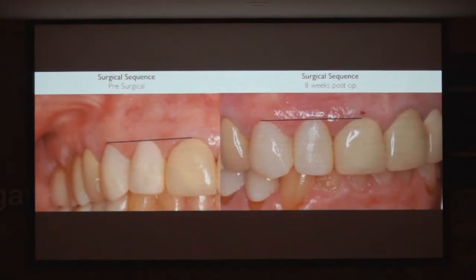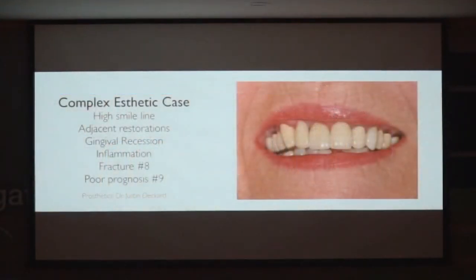So I'm going to go a little quicker through the next case. But the big thing to notice about this case, and I throw this in because I've done a lot of these now, is to show you the only complication that I've had. Okay? And what's the complication we talk about? Well, a little piece of a root will come up. It doesn't come up, the soft tissue recedes. In this case, because there was so much inflammation around this old crown.